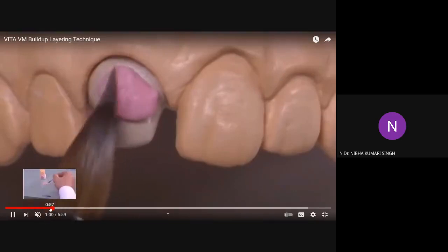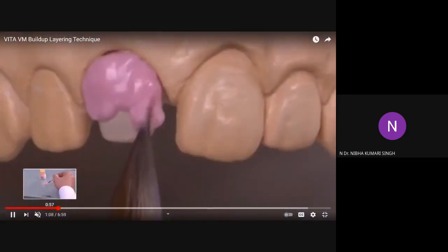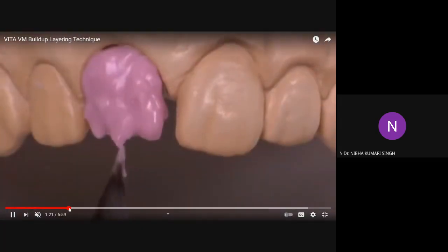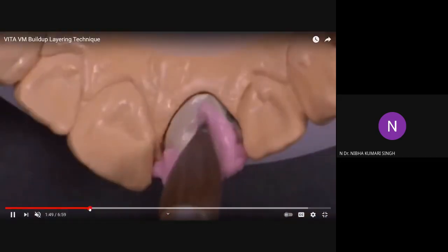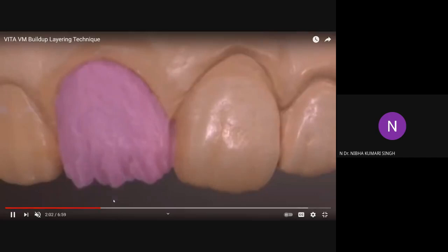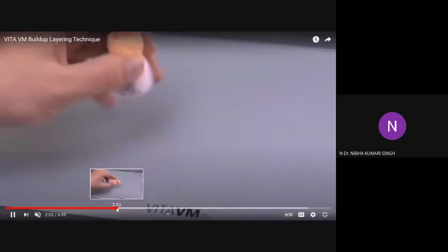So these are the brushes. You can see the special type of brushes by which they are applying this plastic mass onto the die and recontouring it according to the adjacent teeth. They have applied this, and they will do the condensation later. This is what they have applied, the dentin porcelain. Again, they are applying the enamel porcelain.